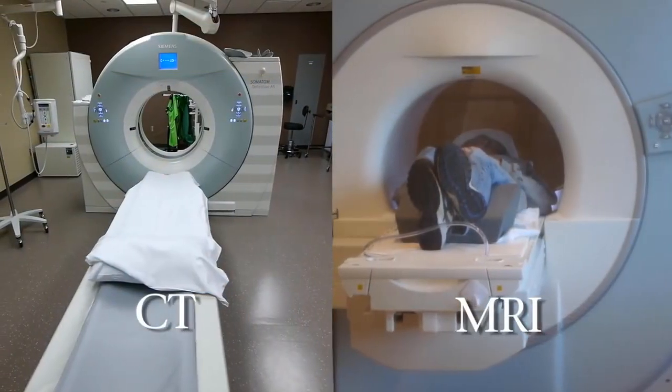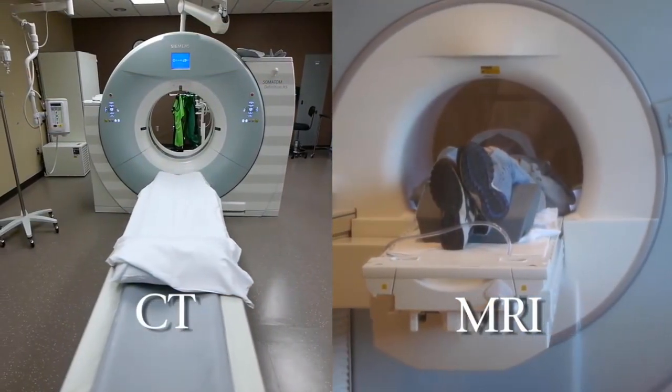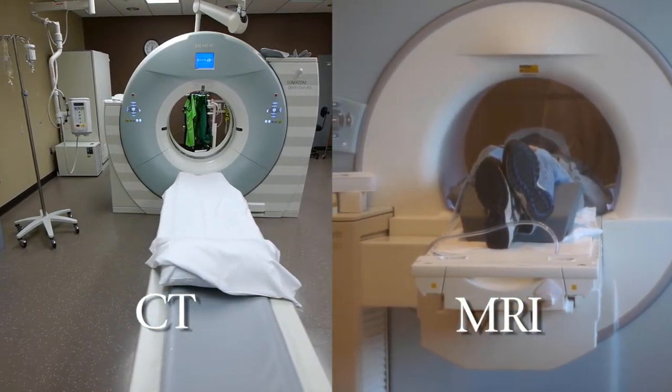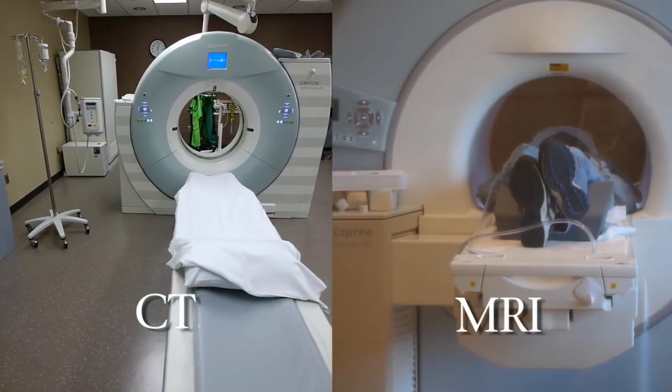The other major difference between the two is quite simply scan speed. A CT scanner in today's world, an abdomen pelvis CT for example, will take on average about 15 seconds to do the entire scan, whereas an MRI to do the same imaging is going to take closer to 45 minutes. And so it's a significant time difference.